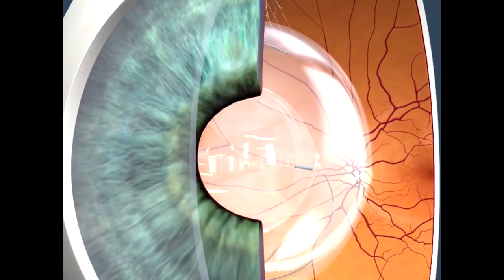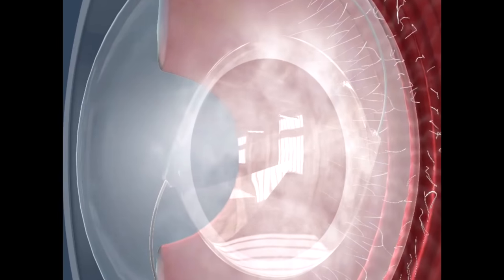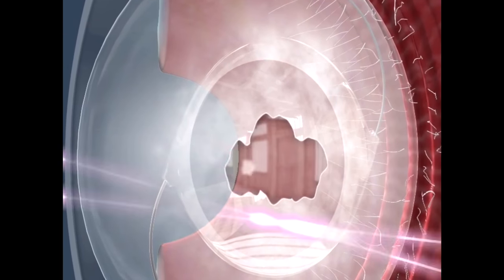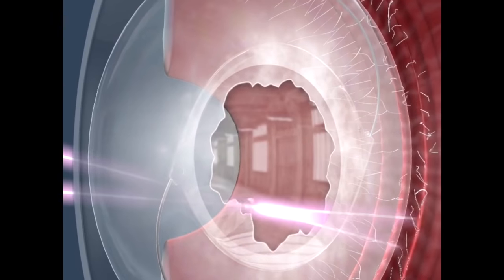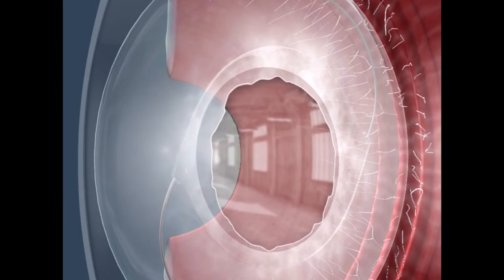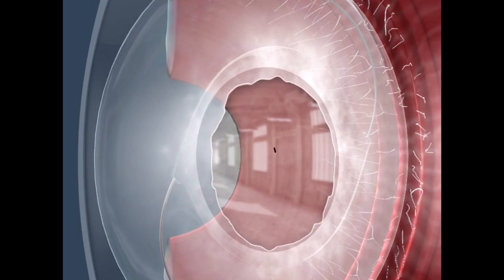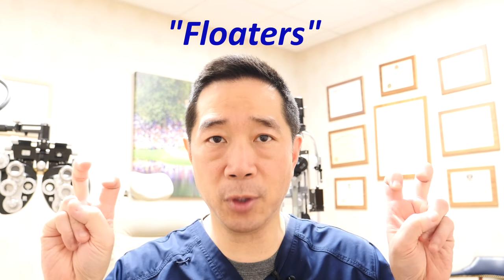YAG capsulotomy is super simple. We use what we call a YAG laser, and the laser is focused onto the posterior capsule. The capsule is opened in a treatment that takes generally about 15 seconds, and then the vision clears up usually within less than a day. It's very safe. The main risk is that because we're using a laser to break up the capsule, small fragments of the capsule might float behind the implant.